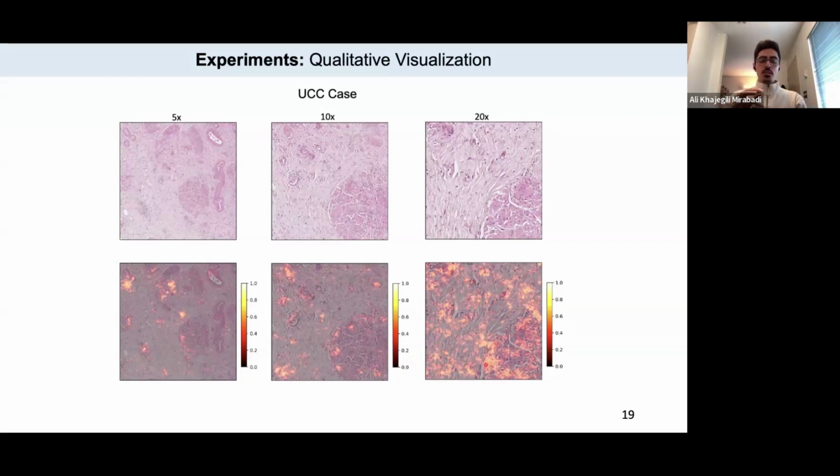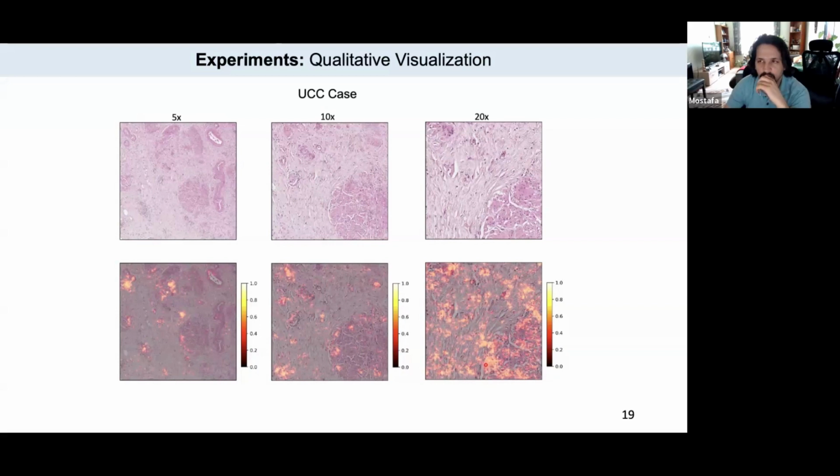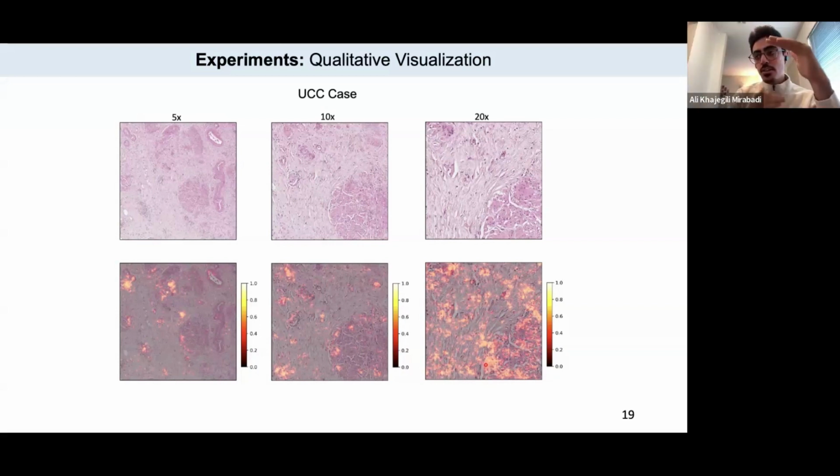And in the node level information, because the level of gradient is different for each set of magnifications, it's hard to compare 2 magnifications together. What you can compare is the nodes within one magnification. You can compare them across 2 different magnifications, but when the model converges, one of the magnifications is way more important. So that node is really important for the model, meaning that the lower magnification is not making me make a decision. So let me just, I found a good one.